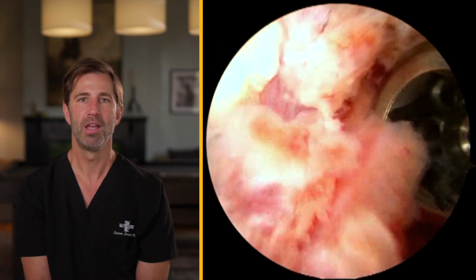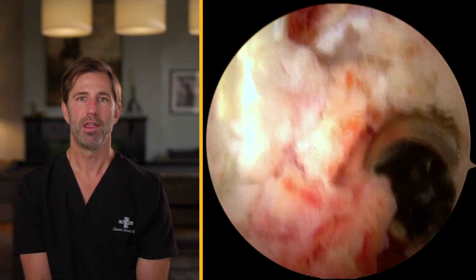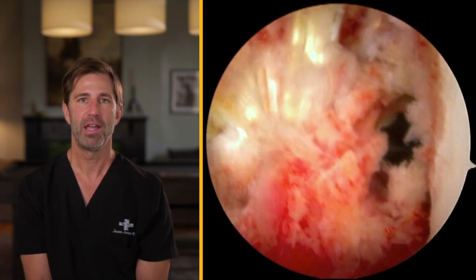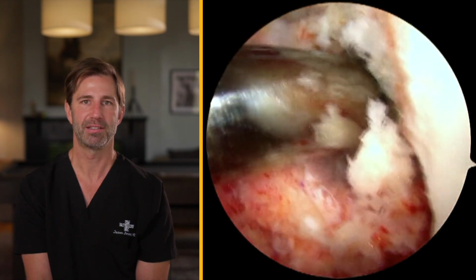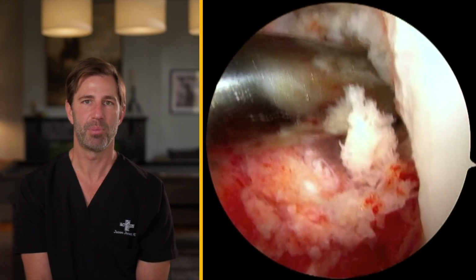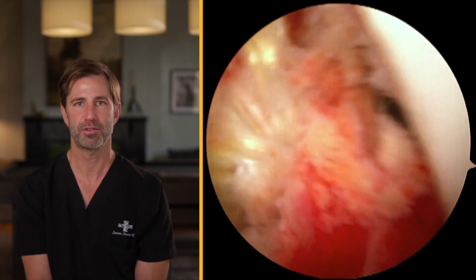screw. In some of these cases, the patient's tendon is slightly longer than the new path that we've created for the ACL. In this case, we can occasionally use different types of screws to allow pressure across the actual tendon itself. When the pressure is being placed across the bone plug itself, I prefer to use metal screws to allow maximum compression across the new bone block.